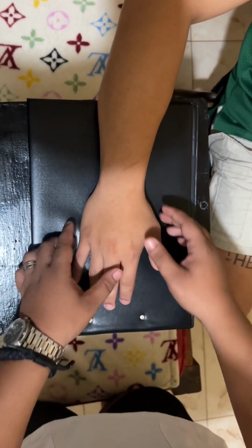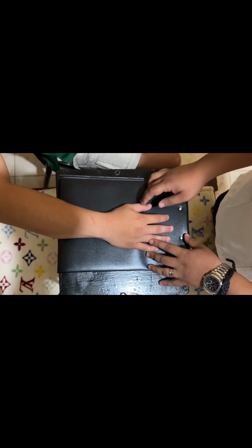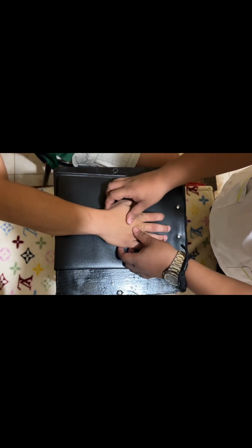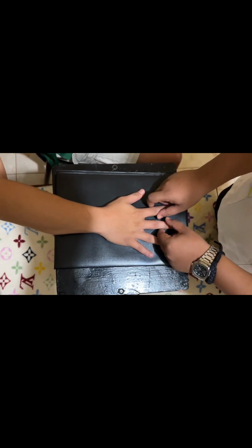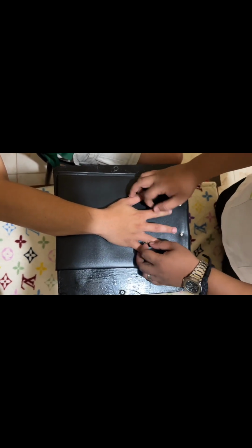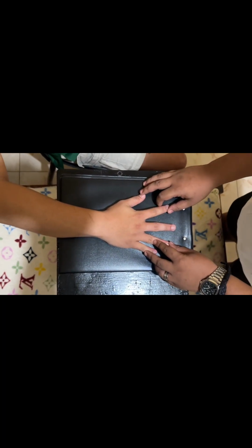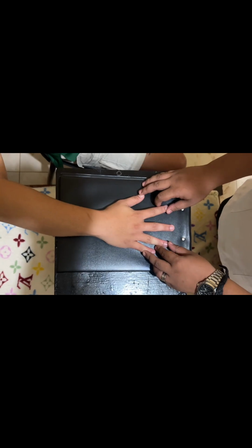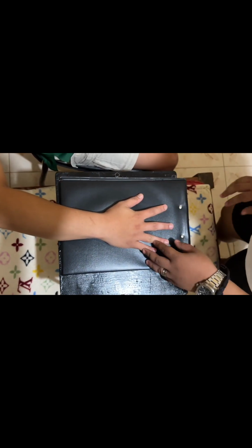So, part position: first, hand pronated with palm flat on the IR. Separate fingers slightly and center the third digit to the IR, and long axis of finger aligned with long axis of IR. And the central ray is perpendicular to the PIP joint of the third digit.